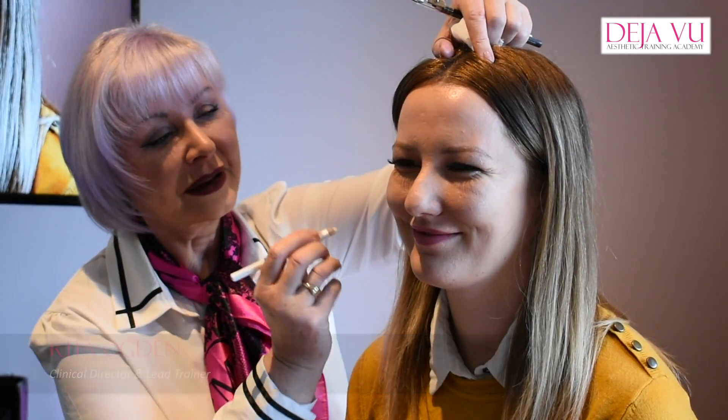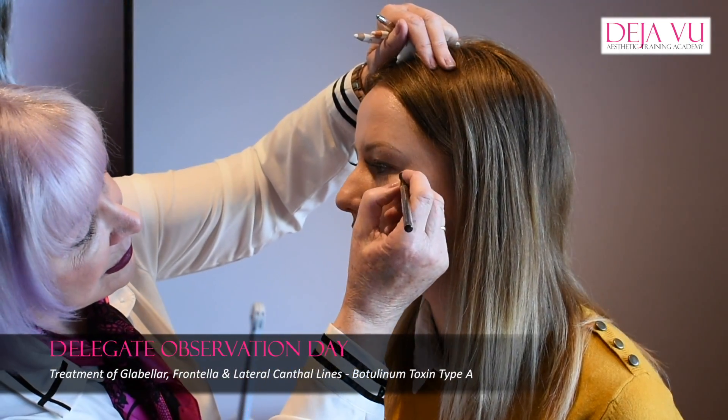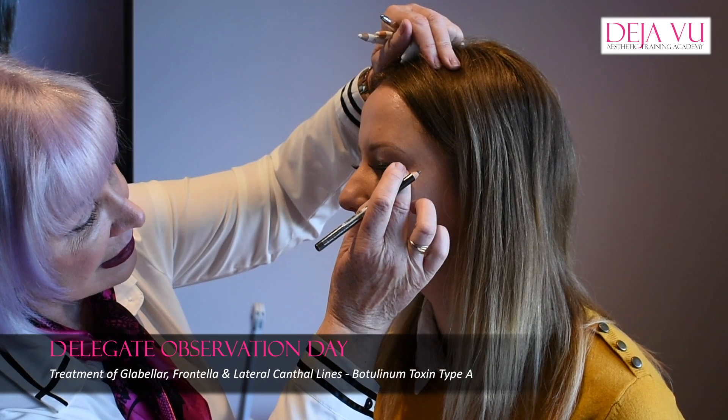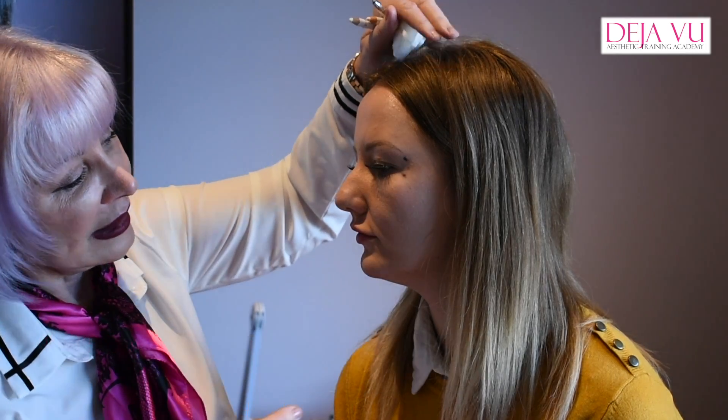Smile for me, Sophie — give a good smile, okay, relax. I'm going to feel for the orbital rim. When you get people to smile, very often they're just going through the motions. You've got to get them to give a good cheesy smile, because you know when they come back they're going to say it doesn't work. So you need to get them to smile properly so you can see exactly how the muscles are working, and also for when you take the photos.